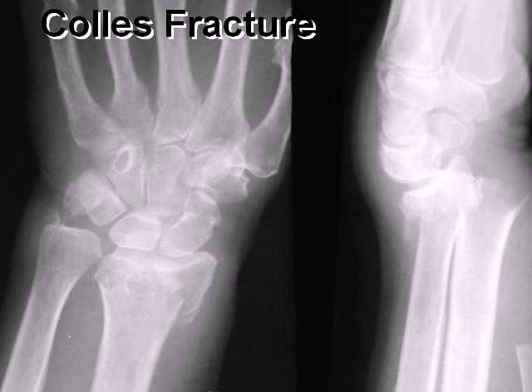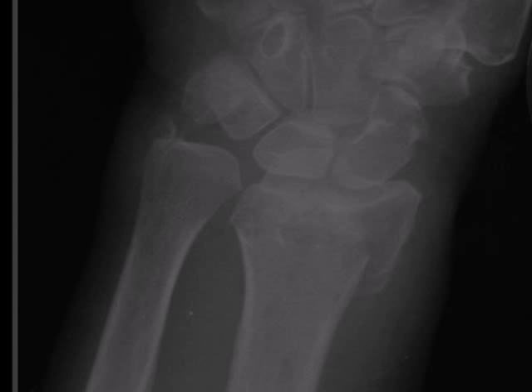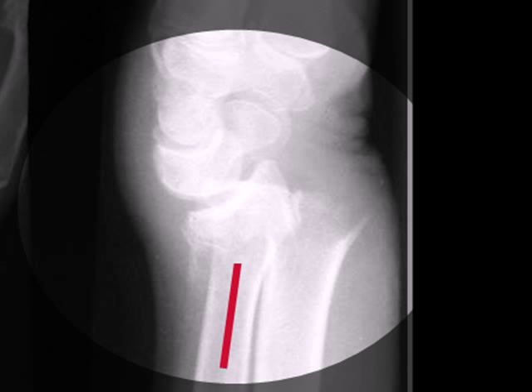This is an example of a Colles' fracture. On the frontal view, you can see the slightly impacted fracture of the distal radius. The red arrow is pointing to a fracture of the ulnar styloid. On the lateral view, you can see the fracture of the distal radius with dorsal or posterior angulation.